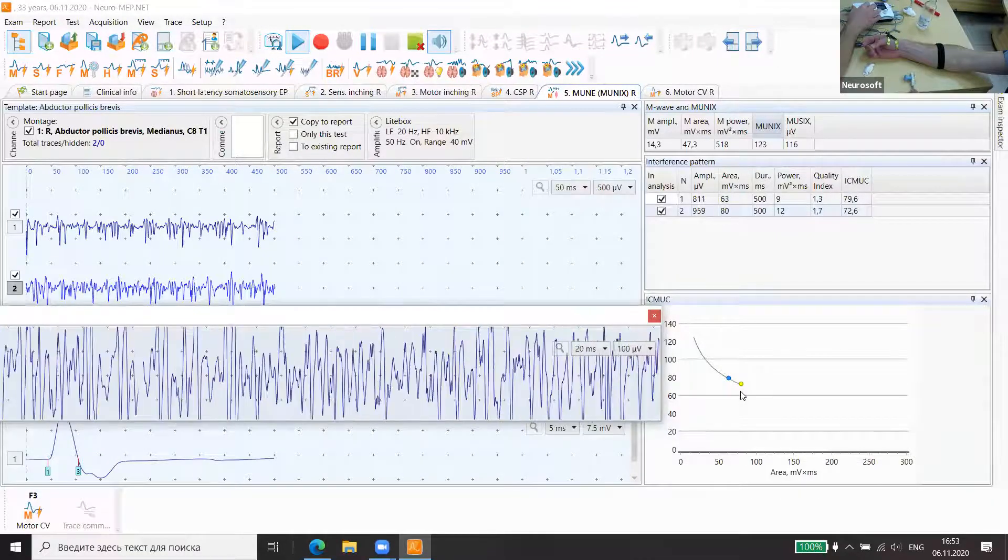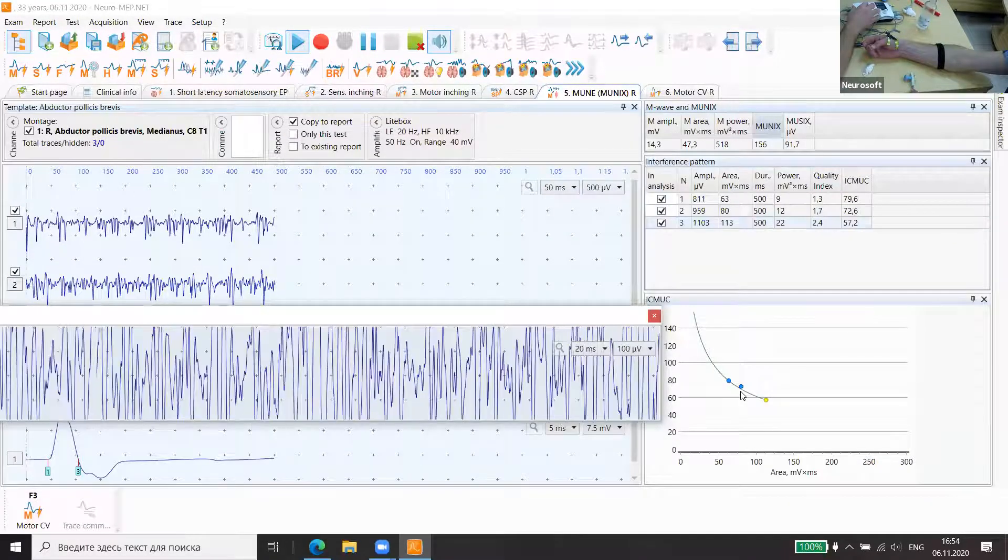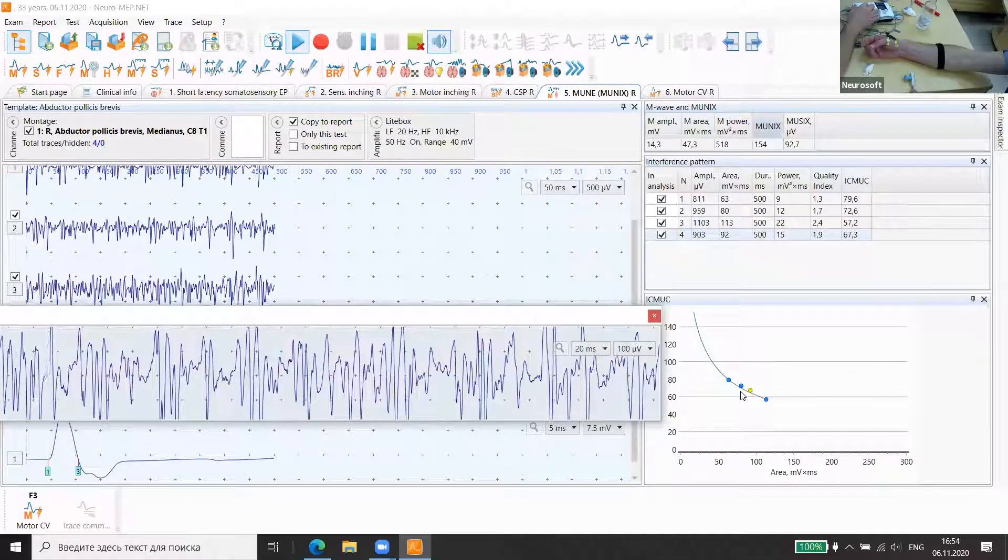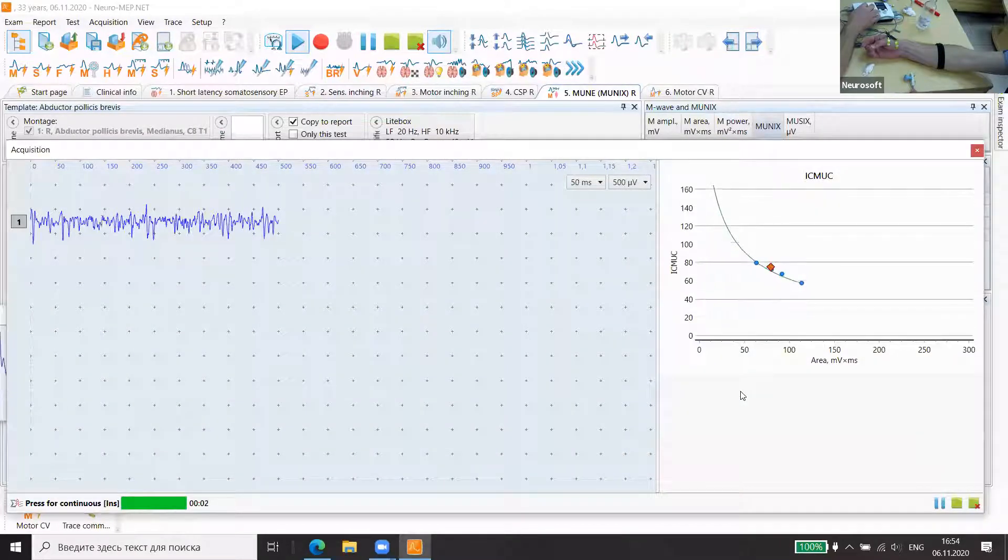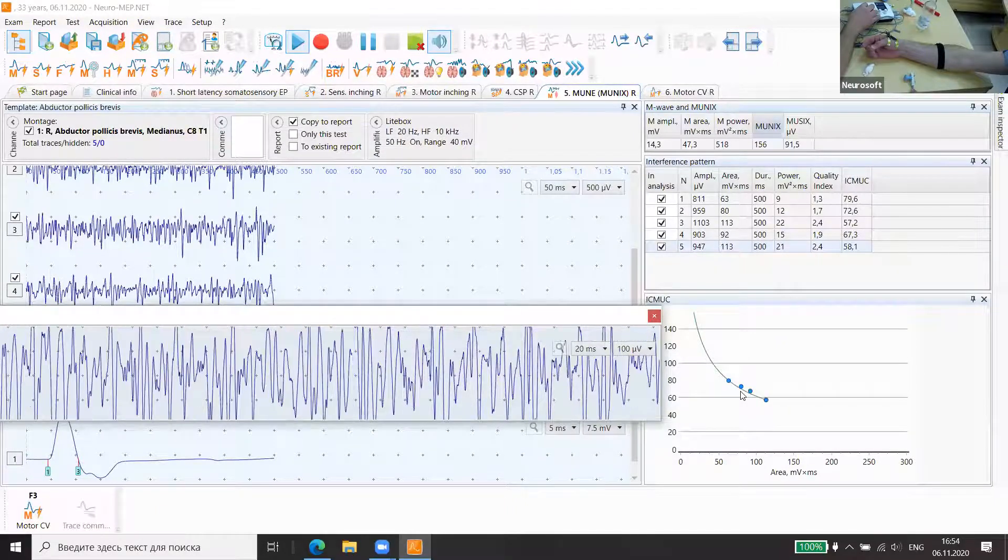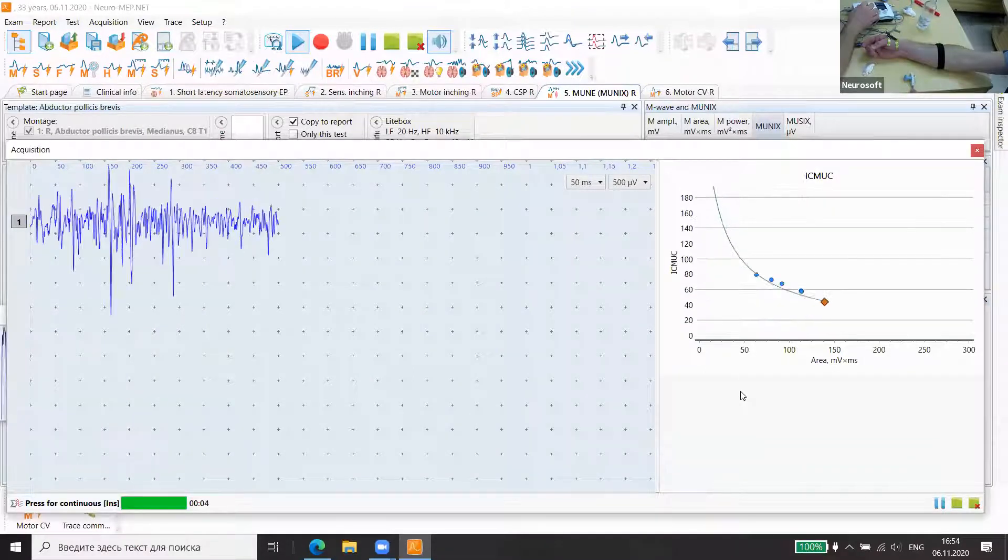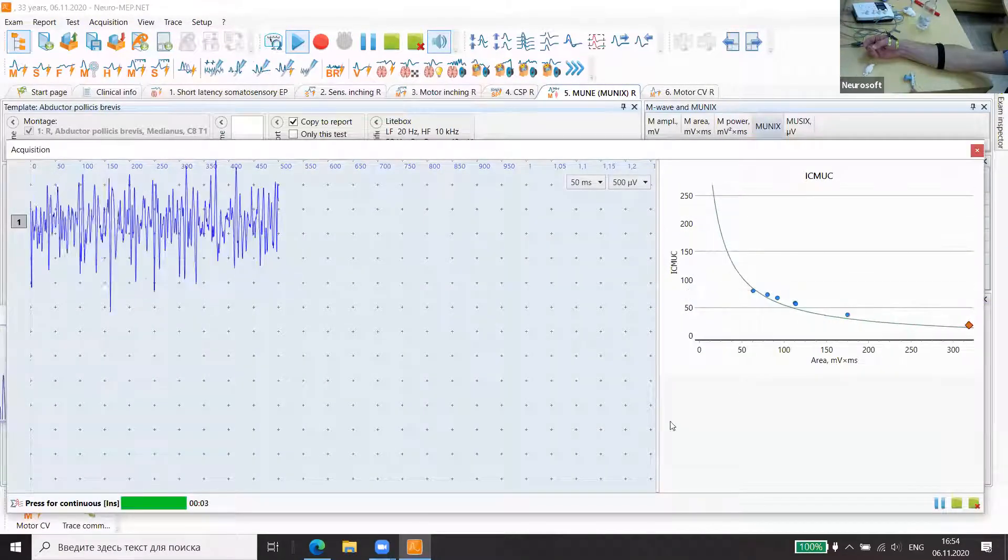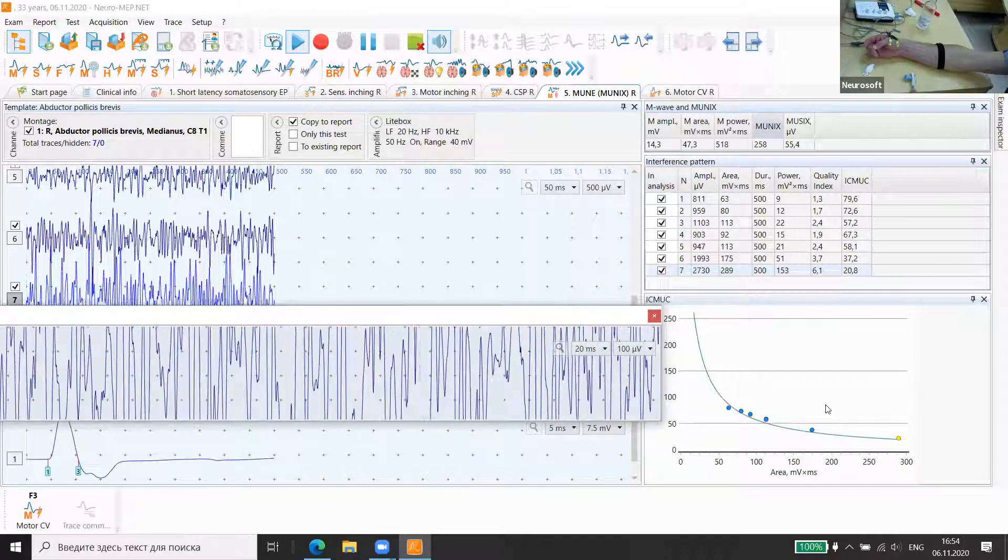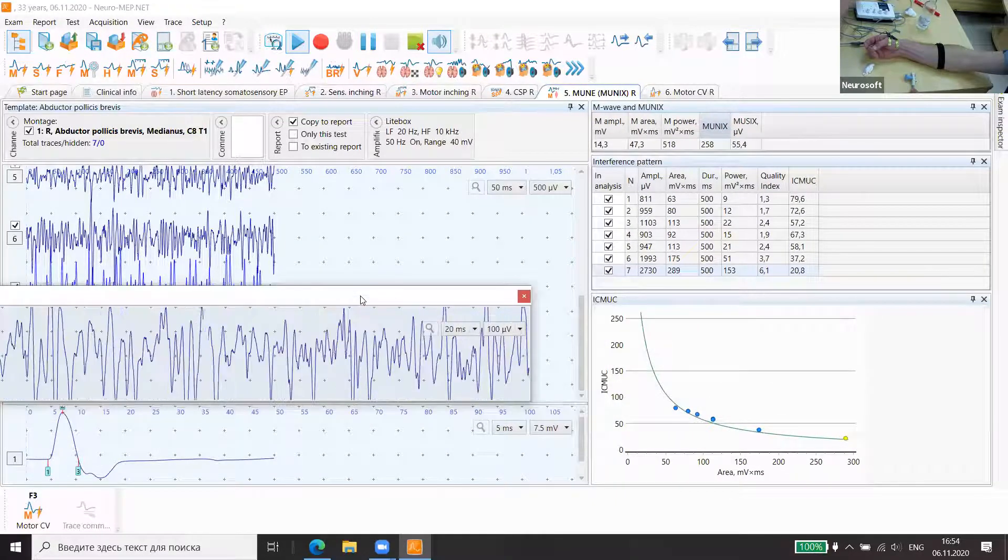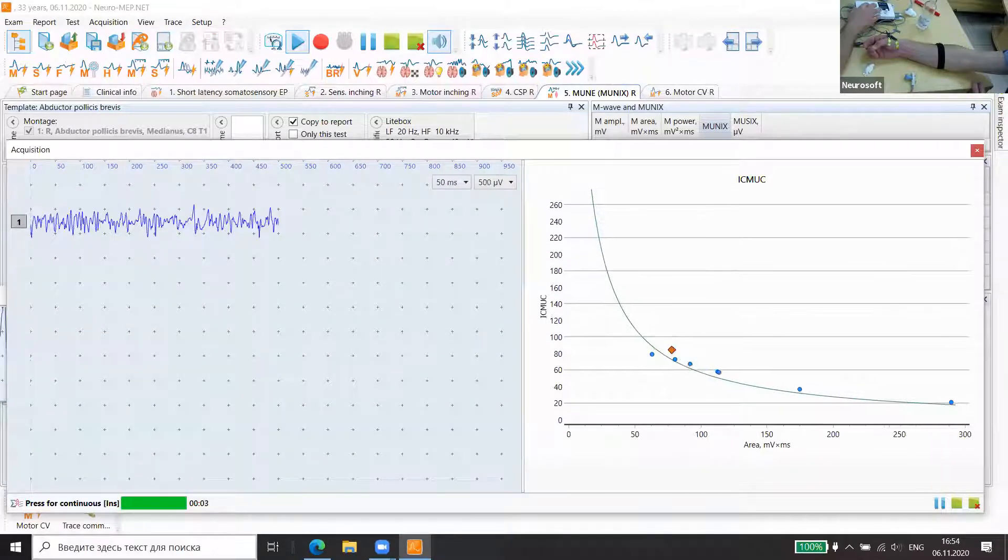Some more tension, some lighter, increase the tension please. We can see our line developing. We can cooperate with the patient to stimulate at different levels.